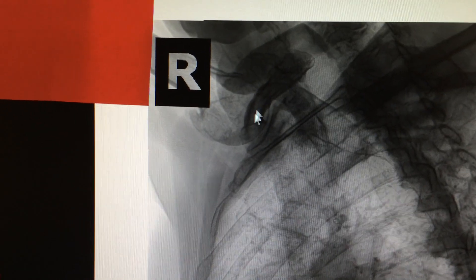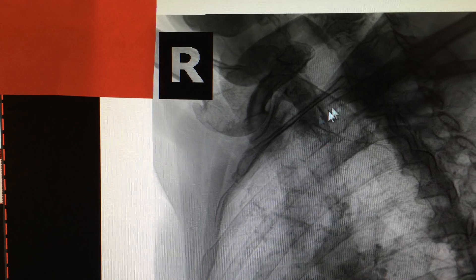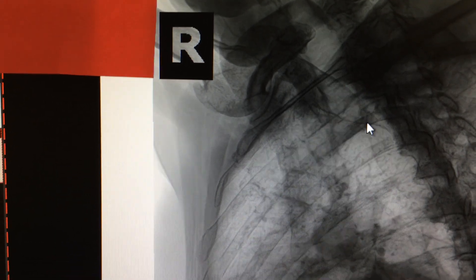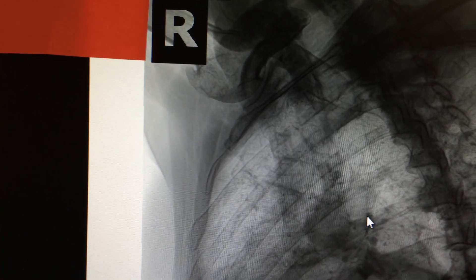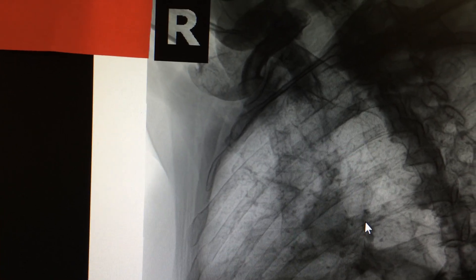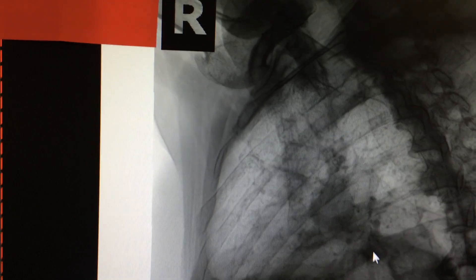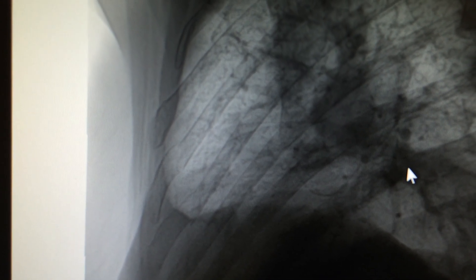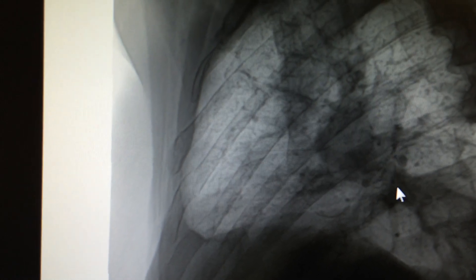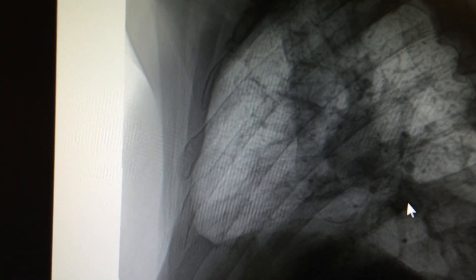I'm going to go from the top: one, two, three, four, five, six — see the fracture here on the 6th rib, and then the 7th rib. So 6th rib and 7th rib — this is the area of the fracture. You can see the displacement on the 6th and 7th rib. This is a classic displaced rib fracture.